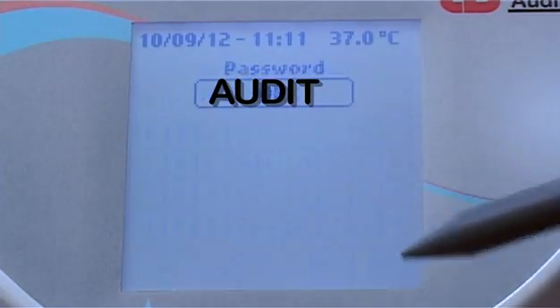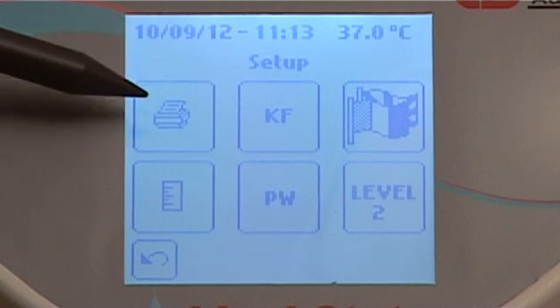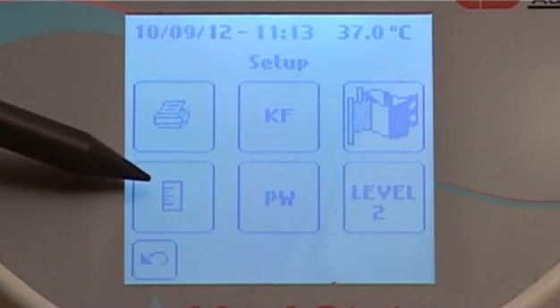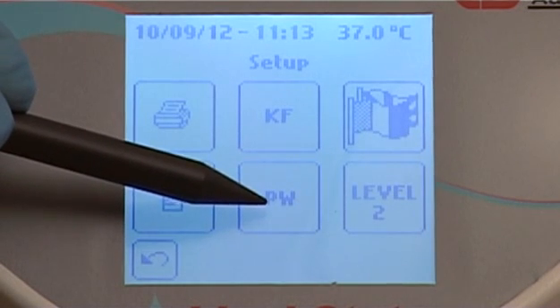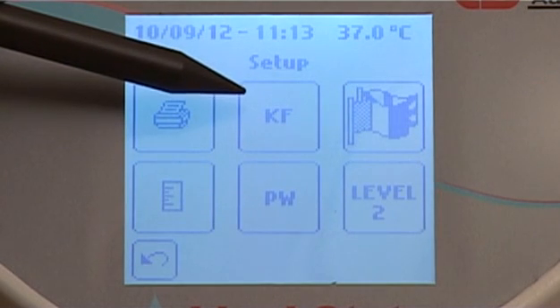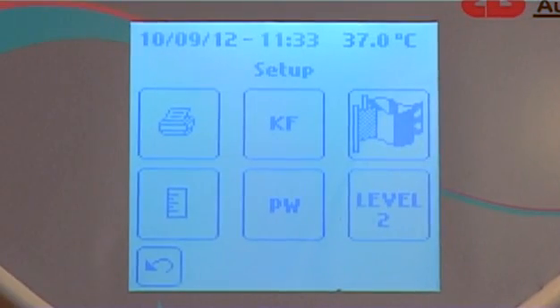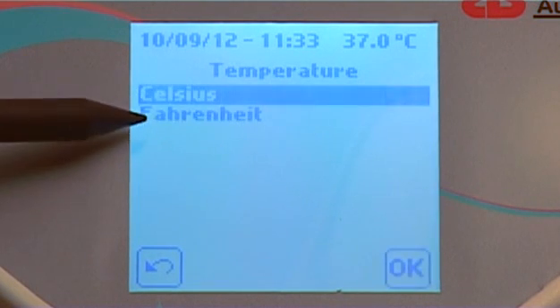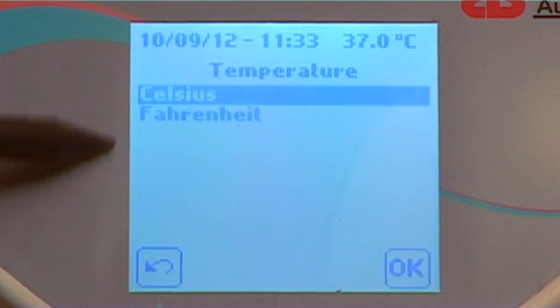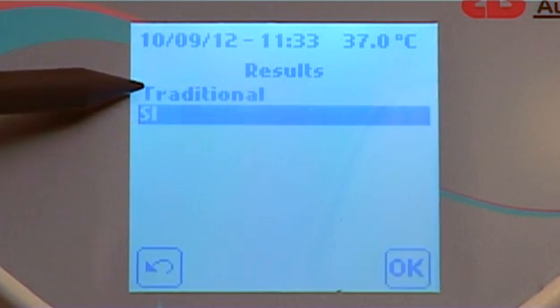Press OK. In the setup menu, the user can change the printer logo, change temperature and measurement units, change their password, change language, add a correction factor, or access the level 2 technical settings. Press the ruler icon to adjust the temperature settings between Celsius and Fahrenheit, and to adjust the results between traditional and SI units.